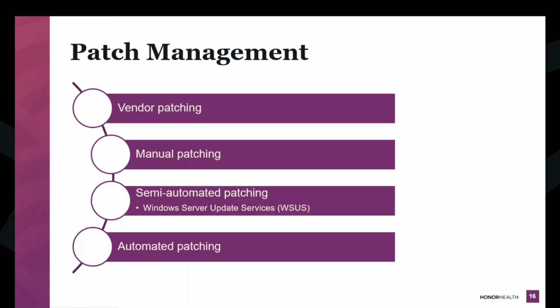Okay. All right, so let's score them. The worst idea, red: automated patching. Please don't. A lot of times, automated patching requires an agent to be installed on the device. If we're talking SCCM, for example, or it now has a new fancy name, ME something or other, yeah, Tucker knows. Not a good idea, because again, the manufacturer will come back saying it was not validated with this agent installed. So please, if you can, don't, unless it's approved by the manufacturer.